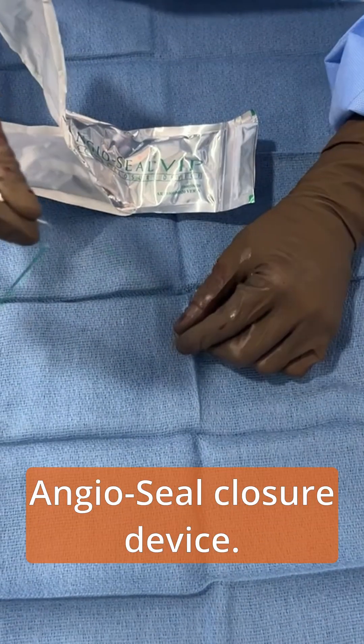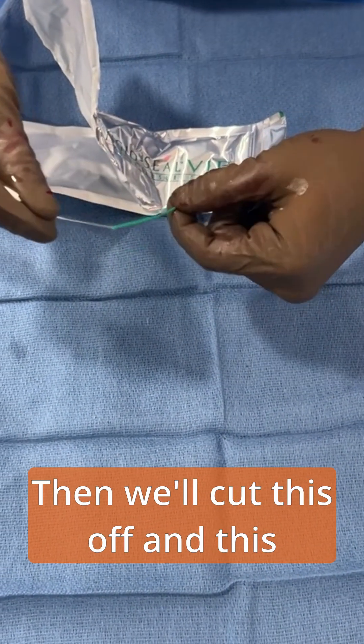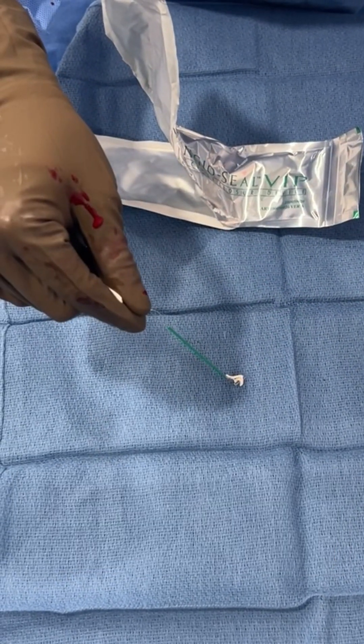So that's it — an angioseal closure device. We'll cut this off, and the suture, the footplate, and the collagen plug will all dissolve within three months.